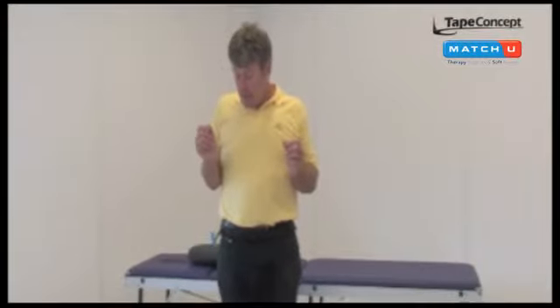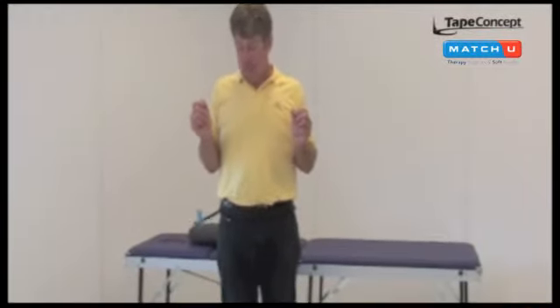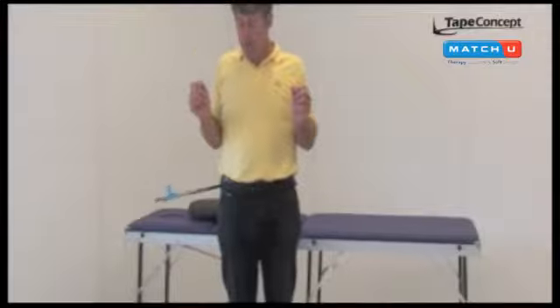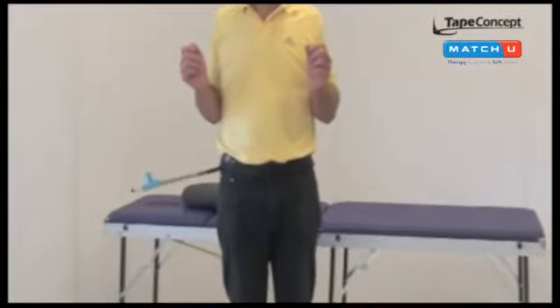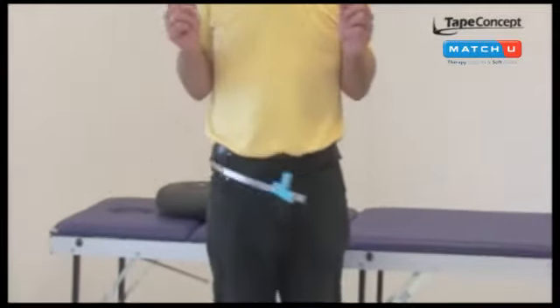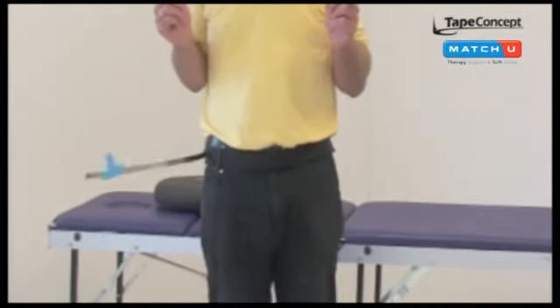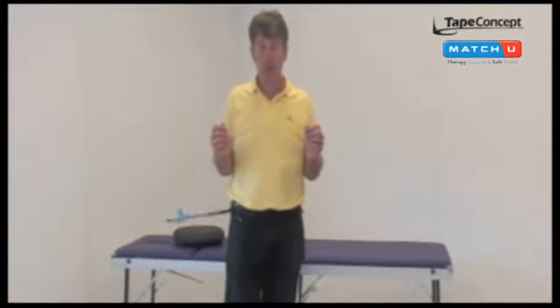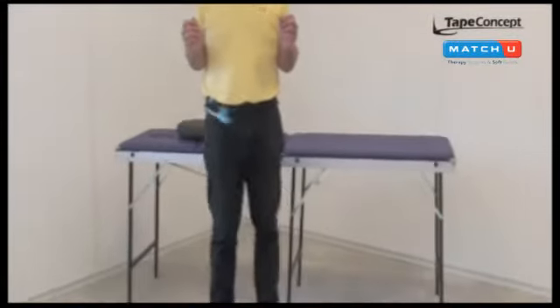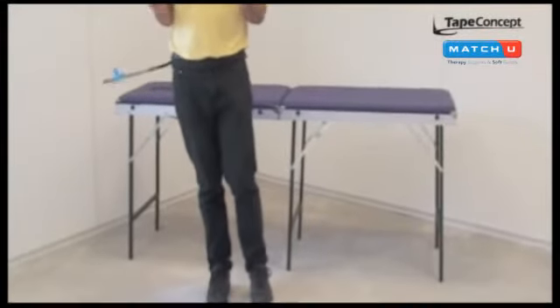The exercise the patient has to do is standing and just keep the device swaying. If he is able to do this, he can do the same exercise standing on one leg, then changing weight and standing on the other leg.